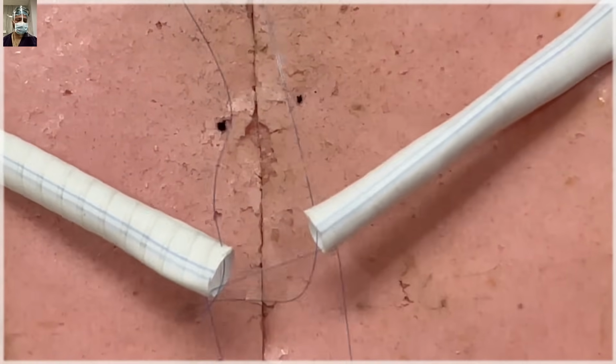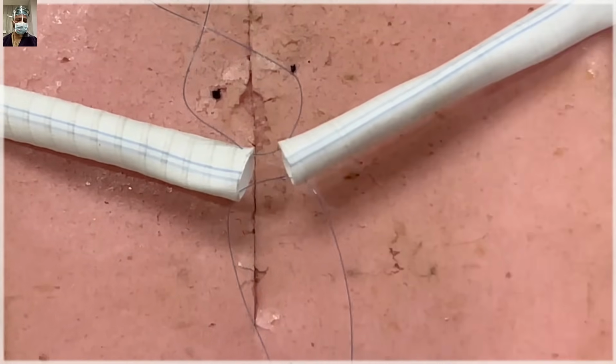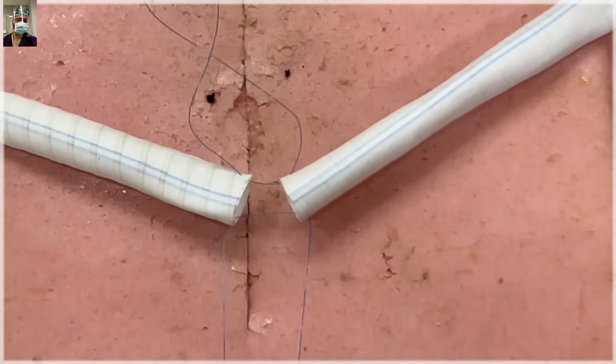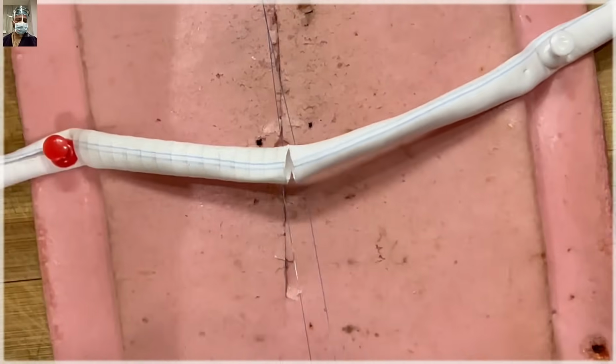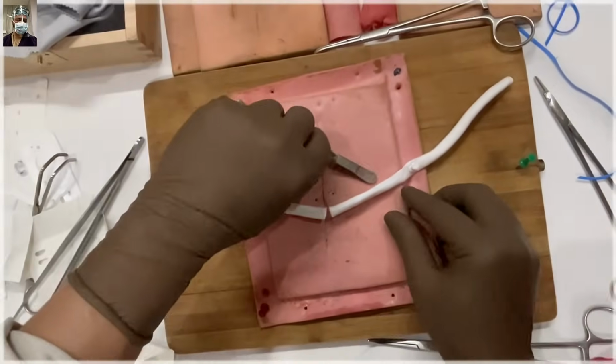And here, just to save the suture, I'm taking it this way. Otherwise, in a real life scenario, it always has to be a double arm suture, and you will always come inside out on both ends. So I have taken this 6 o'clock suture. Again, I am not applying knots here, and I will keep it as such so that they stay aligned. The blue line, as you can assume, is the marking.